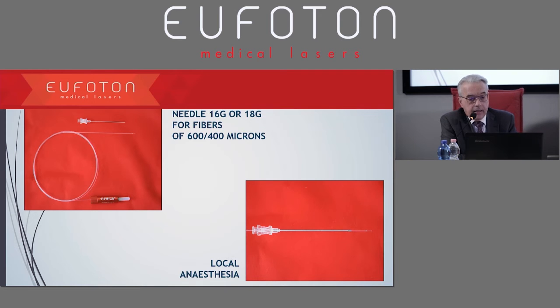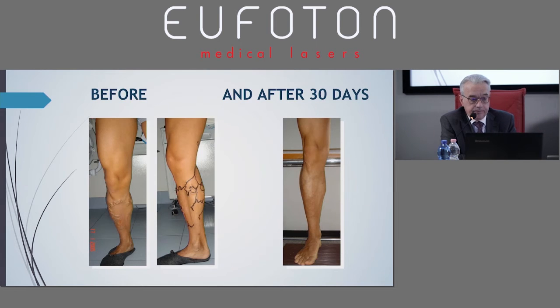This is our equipment. We have to use some local anesthesia. We should also use cooling. We will see later the cooling, air cooling by direct contact. The more we cool the cutaneous side, the better results we will have from an aesthetic point of view. These are images that Dr. Zini also allowed me to use, before, after, and at 30 days.